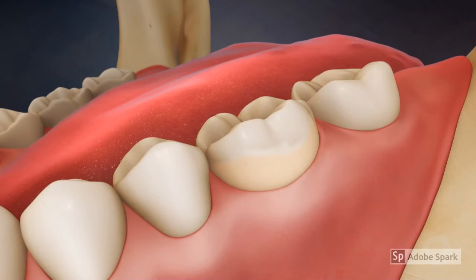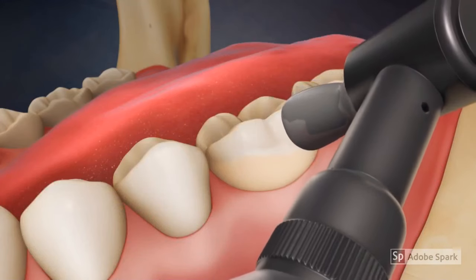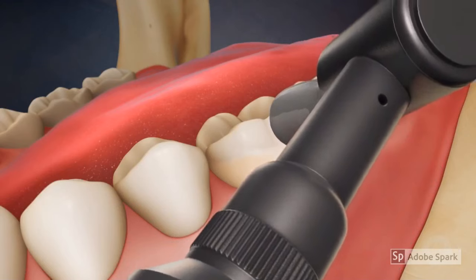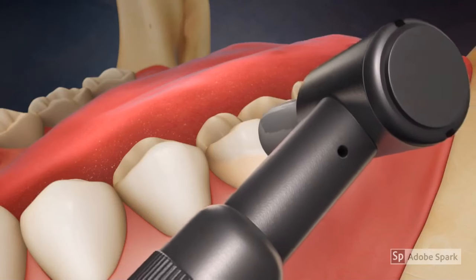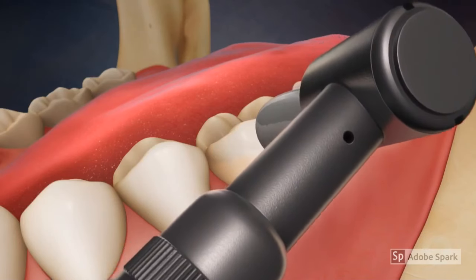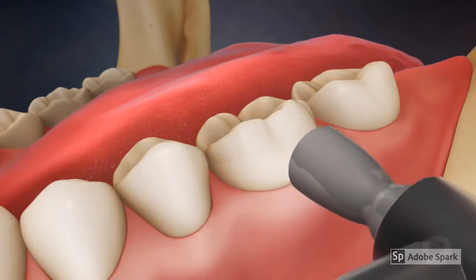Once all the surfaces are smooth, you may have your teeth polished. Polishing is done using a slow speed handpiece with a soft rubber cup that spins on the end, along with a special toothpaste-like material. Polishing serves to remove the final bacterial film that forms naturally on the teeth.